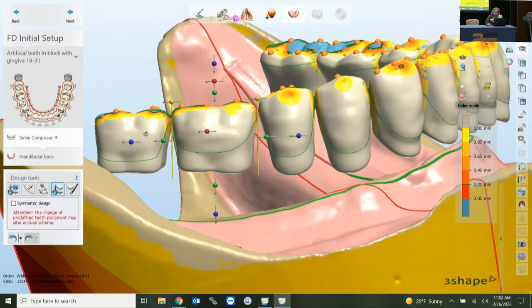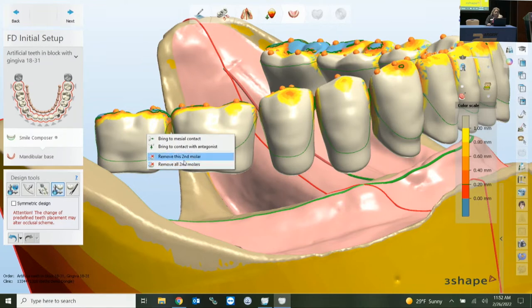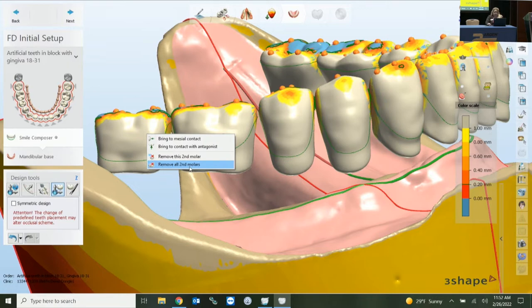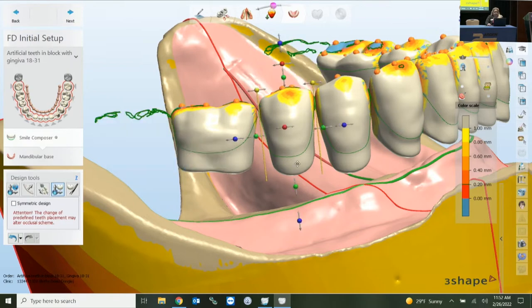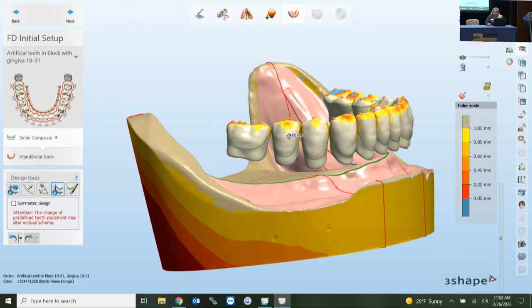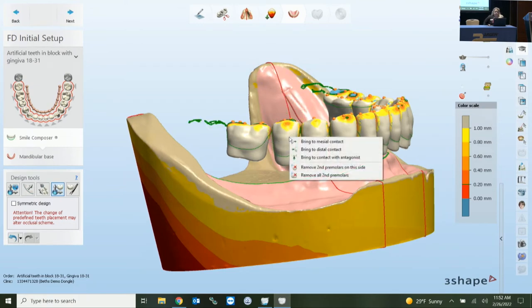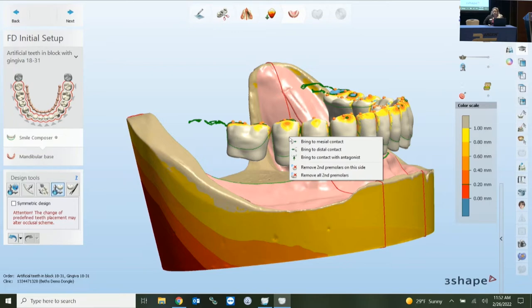You'll have that remove option whenever you're dealing with a single arch or double arch. You can also remove the second premolar — it limits removal to the second premolar and second molar only. One important thing: if those teeth are not in your order form, you cannot just add them in the design. If you're unsure whether you need them, the best option is to include them in your order form and then remove them in the design. You also have options for bringing to mesial contact and distal contact.